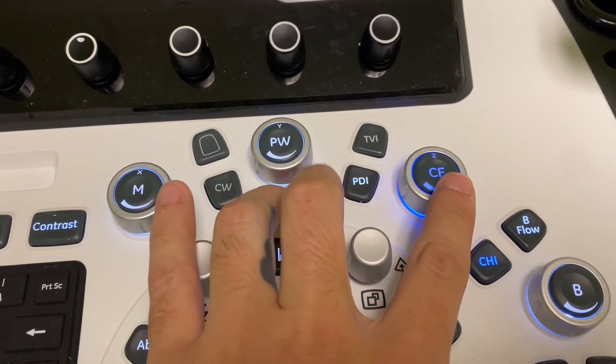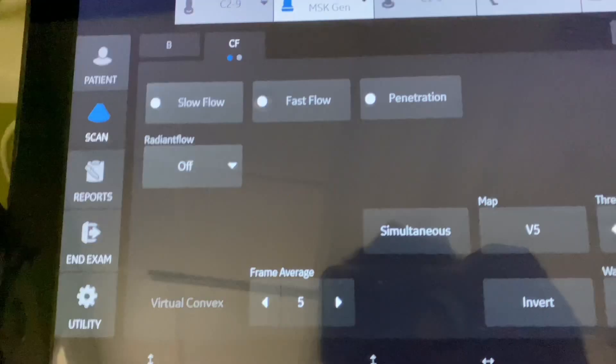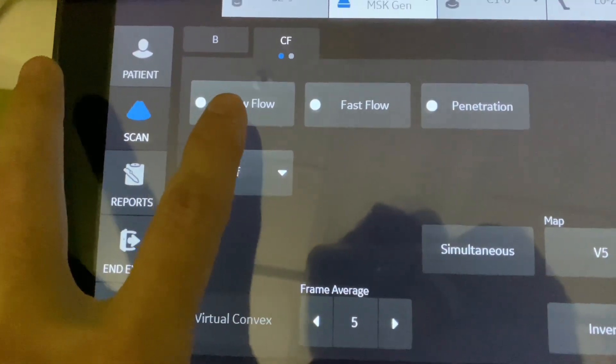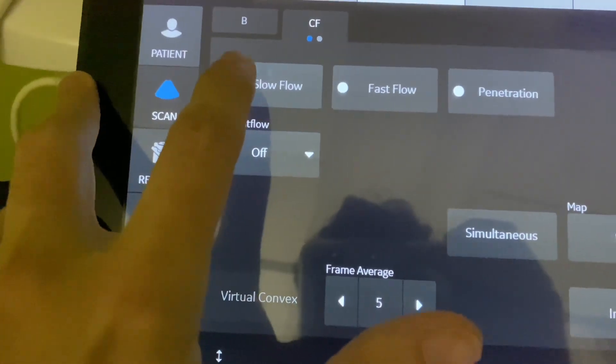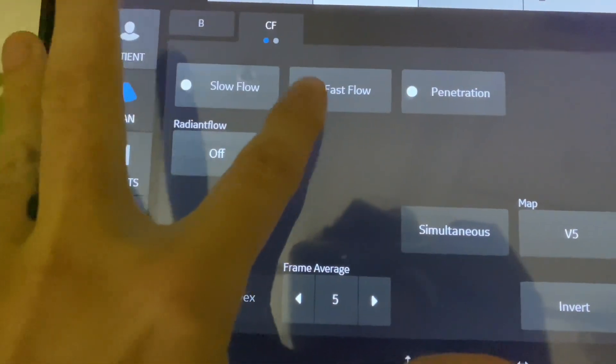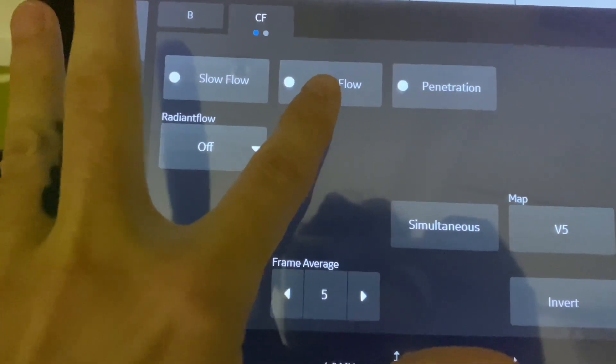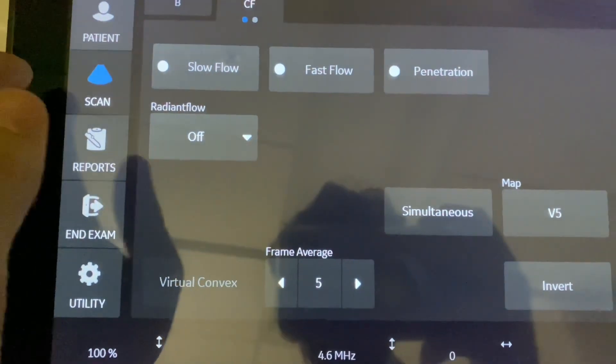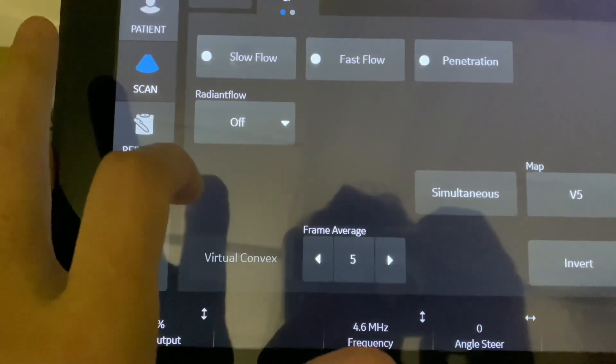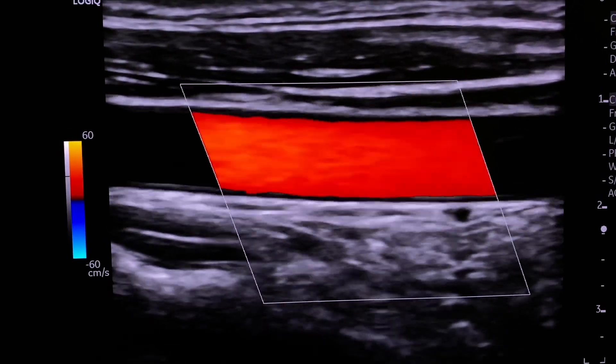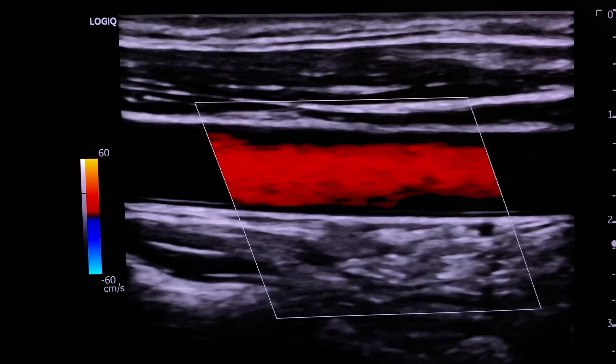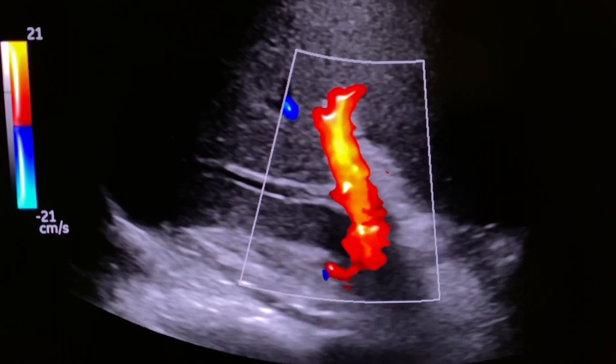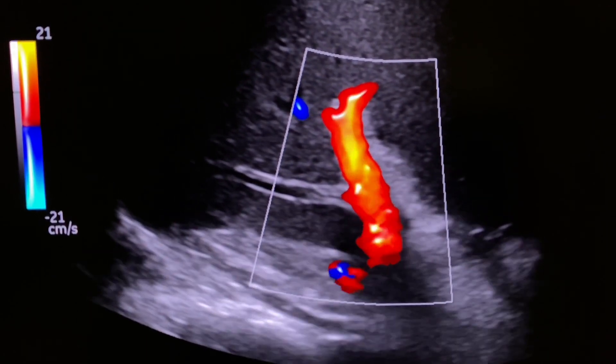When you hit color flow, some more stuff comes up on the screen. So you have slow flow if you want to pick up tight stenosis. If you have that, you can press that and pick that up. Or if you're doing like a renal artery or intrarenal flow, you can use the fast flow or penetration for larger patients. And then you have the radiant flow, which is real pretty. This is an example. Here's a color Doppler on the carotid, on my carotid. And there's radiant flow in the portal vein, almost looks like an upside down boot.